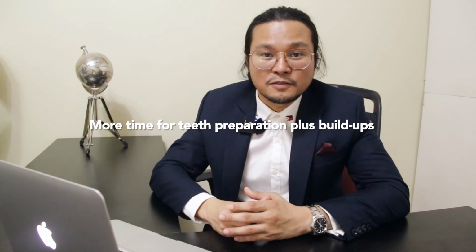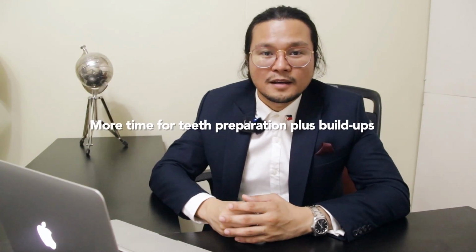Okay, so with the teeth preparation process, it took me more than expected. I mean, extra time kasi I did a lot of build-ups with this one, making sure that everything's cavity-free. I removed all the carious cavities, and then considering all aspects like the soft tissue, the gums, that's really important. And soft tissue management is not easy, especially for some cases. That's why sometimes it will take a bit longer than expected.